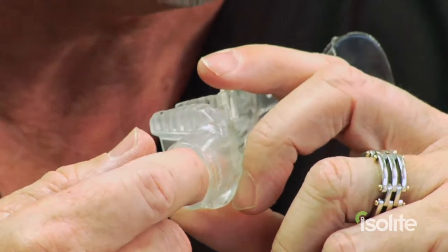The throat part of the Isolite mouthpiece is where the head of the Isolite system attaches to and connects to the light source and your vacuum system. So those are the parts of this mouthpiece — they all work together to make your patients' visit much more comfortable and to make the dentist's or hygienist's time in the chair much more productive and much easier on you too.